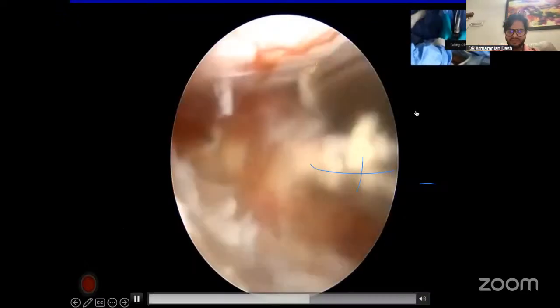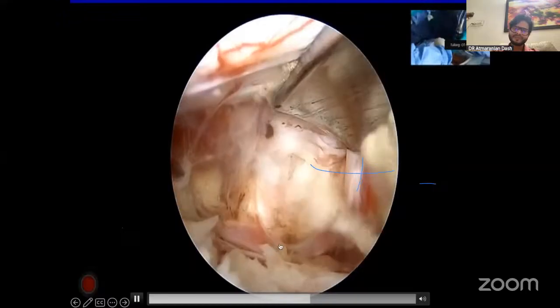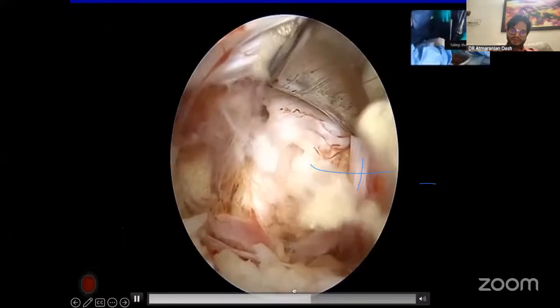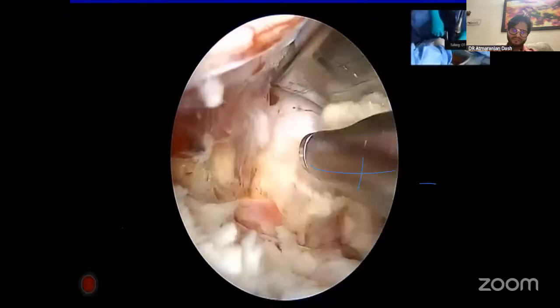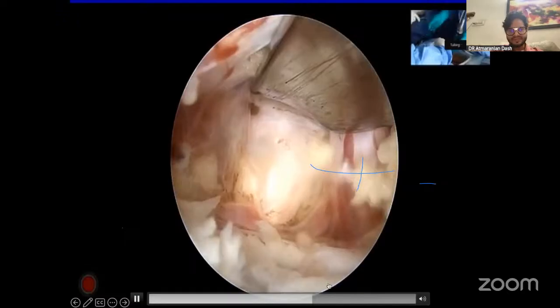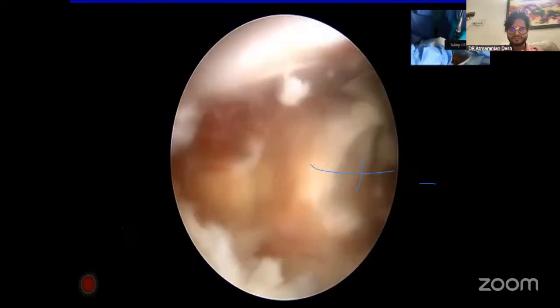So it becomes very easy for the surgeon to remove those discs and remove the things completely here. So you can see the disc bulge here. And we just expand the annulotomy with a Kerrison a little, so that you can remove the discs very well. You can do the work very precisely here, and you can see the disc coming out. You just compress it a little and the disc comes out on its own.